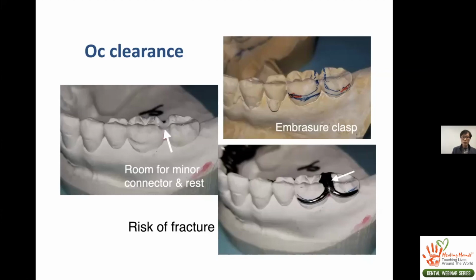So this is another patient case. You can see an occlusal rest seat was prepared between two mandibular molars. A textbook may say we have to develop at least 2.5 millimeters in width and 1.5 millimeters in depth. But sometimes the space may not be enough, because we want to make sure that the clasp assembly in that site is durable enough to resist the occlusal stresses. So oftentimes if the occlusion is really heavy, sometimes we have to do some enameloplasty on the opposing dentition. And also later we are going to talk about that. We have to make sure that there's a good undercut for the clasp assembly.